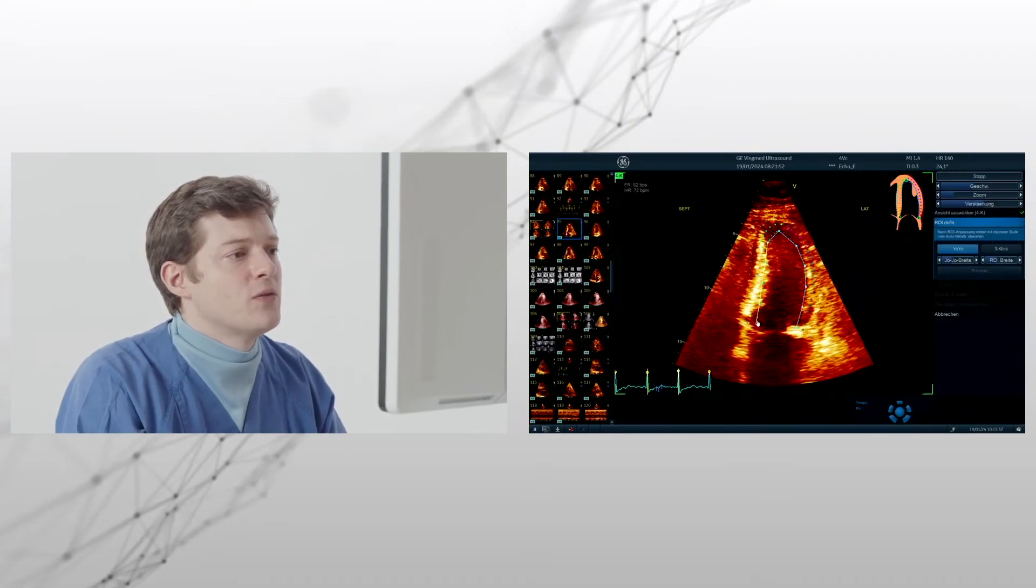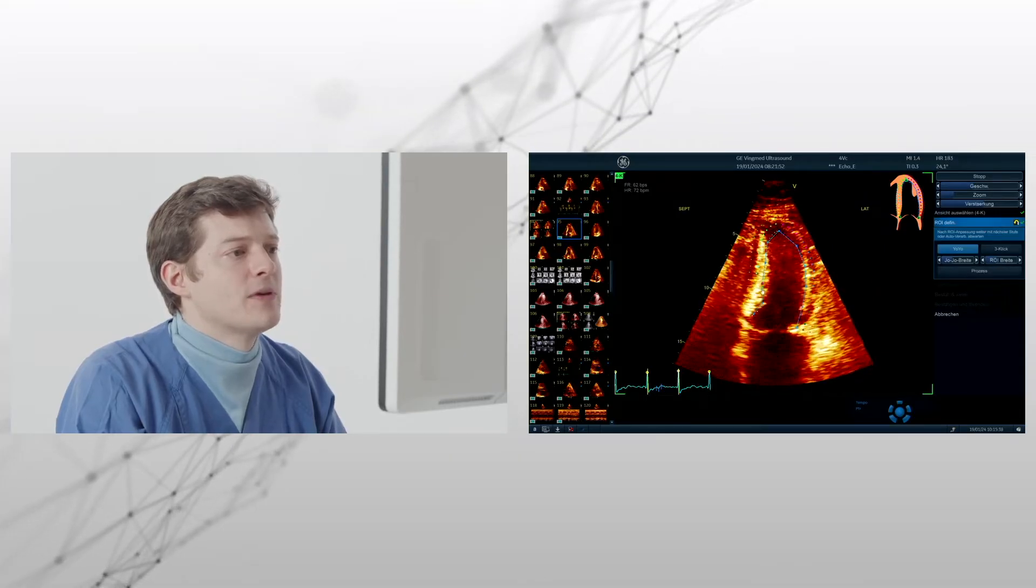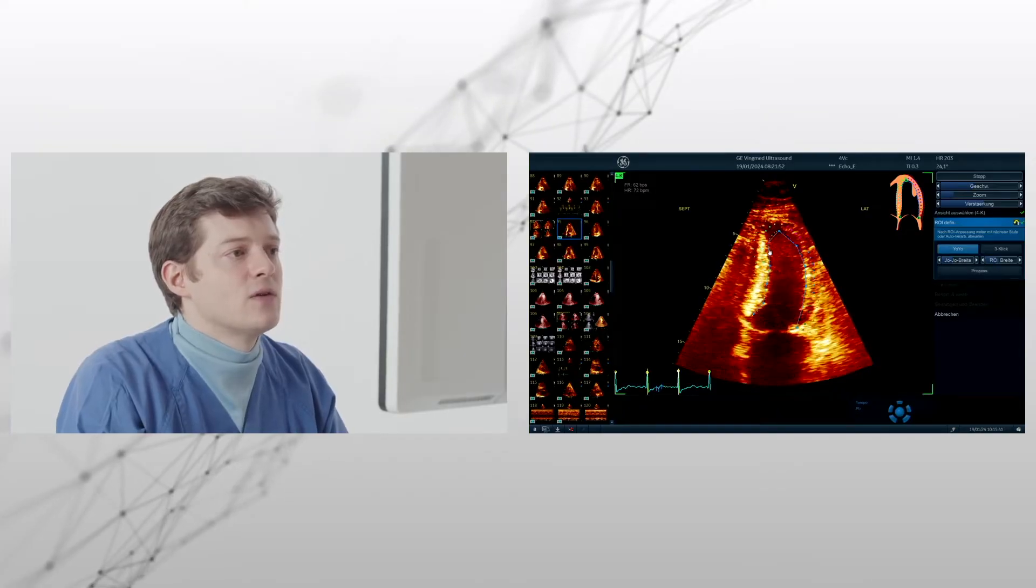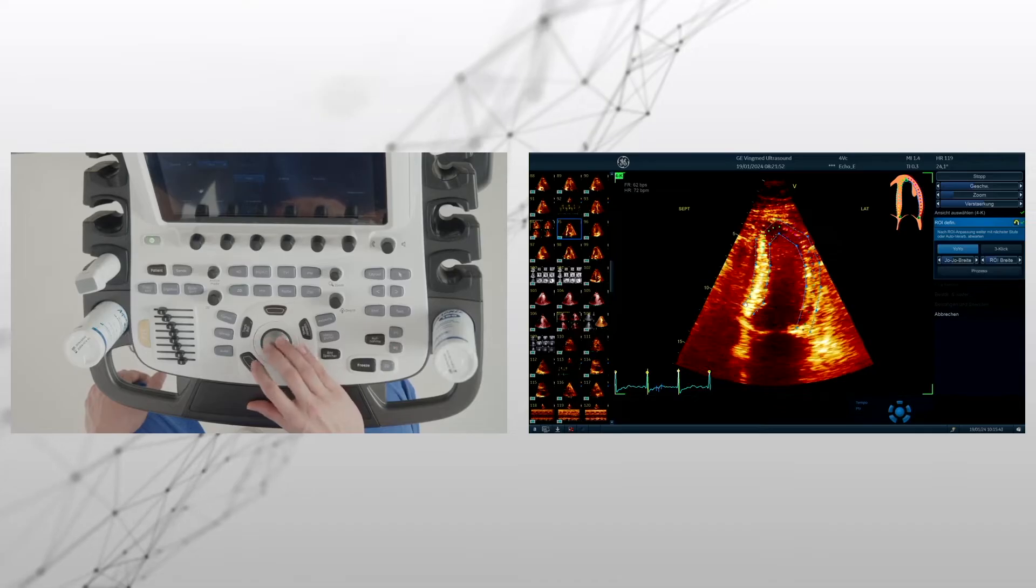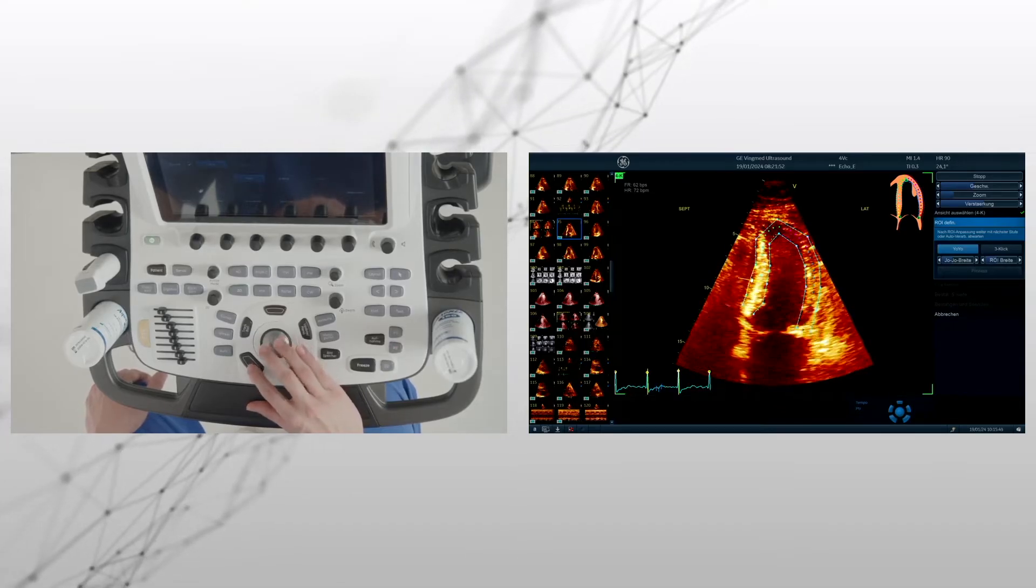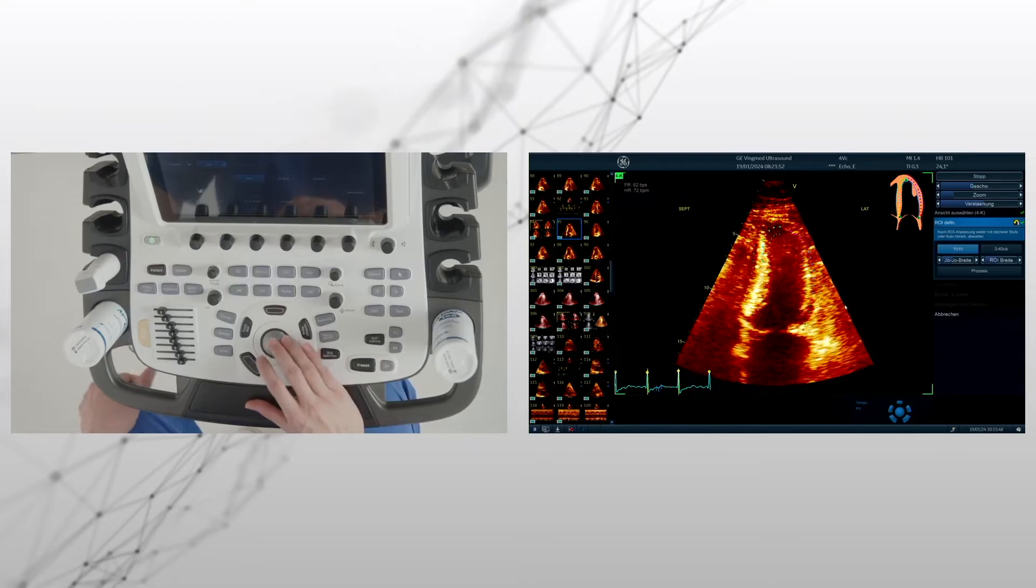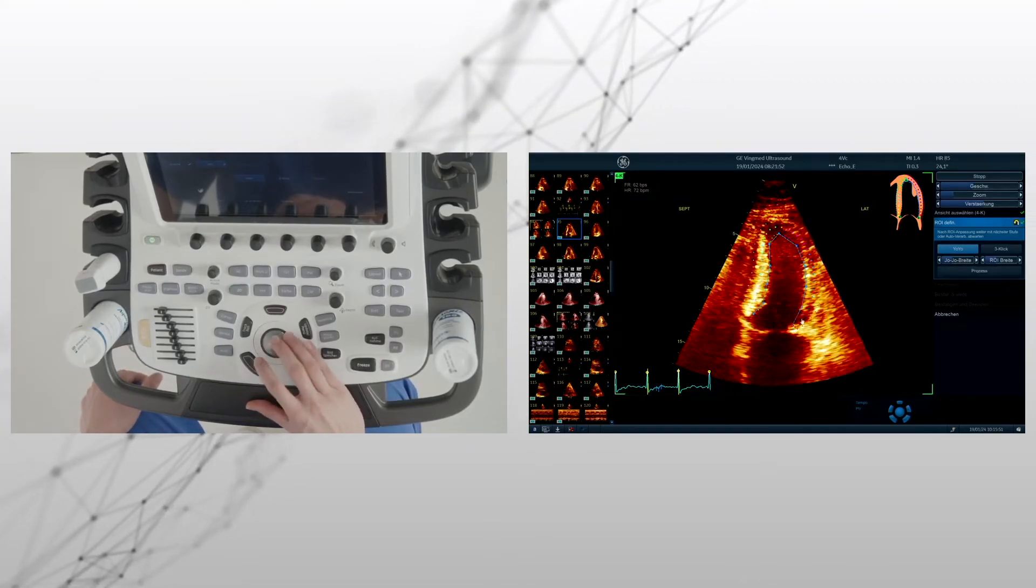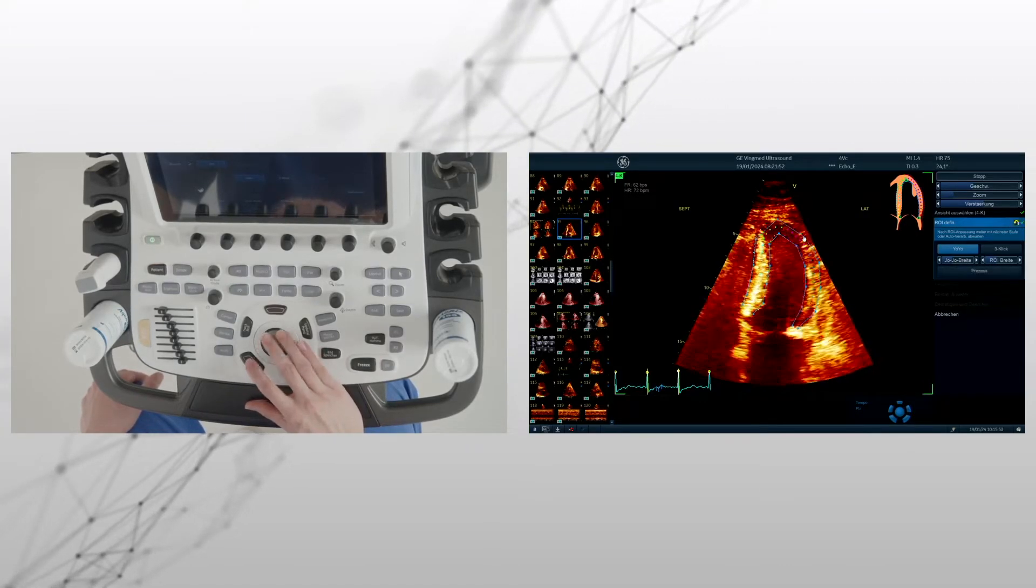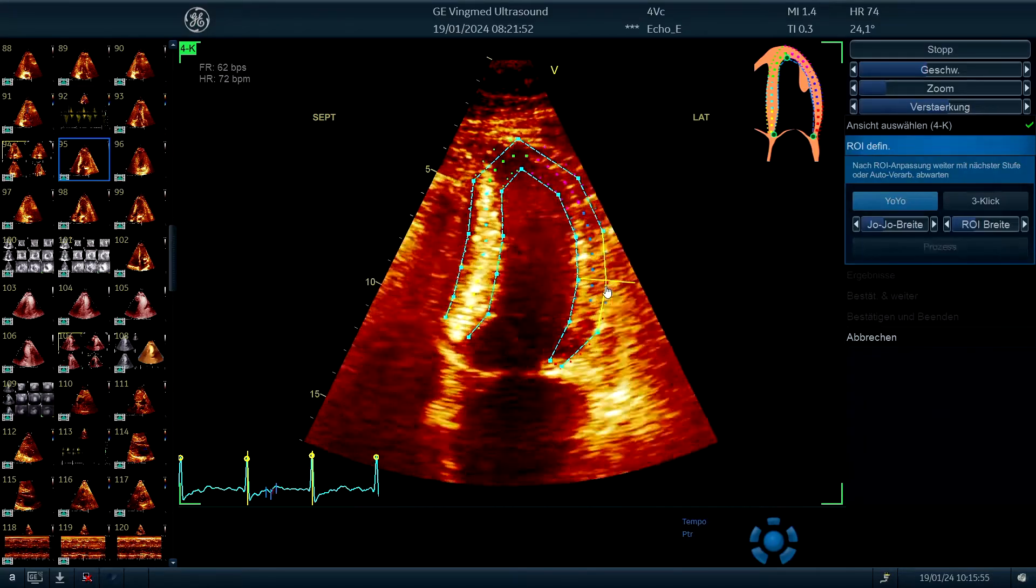In the four chamber view we also have to adapt, but again, use a region of interest which fits the most parts and do not measure blood or the pericardium. So we have to adjust a little bit, but overall this will be fine.